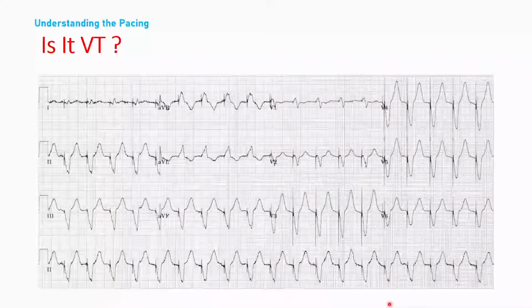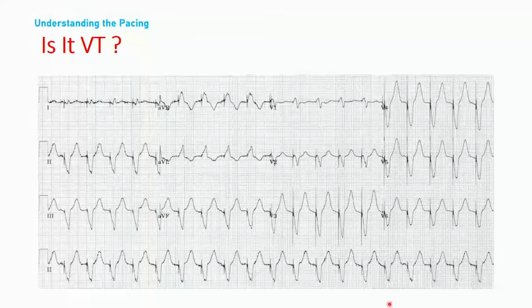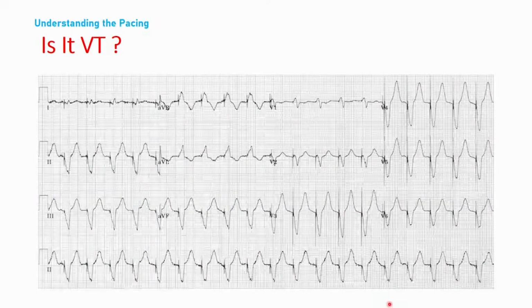This is again a question: is it a VT? Everybody knows what an arrhythmia is, right? Is it a VT? When you get a rhythm and an ECG like this, we cannot say it is VT, right?